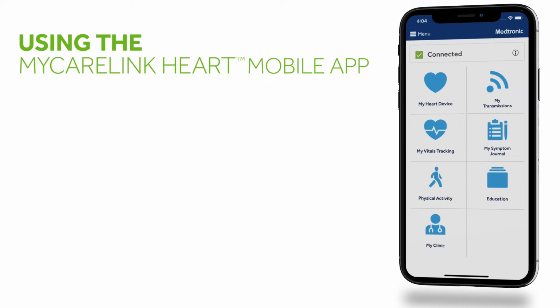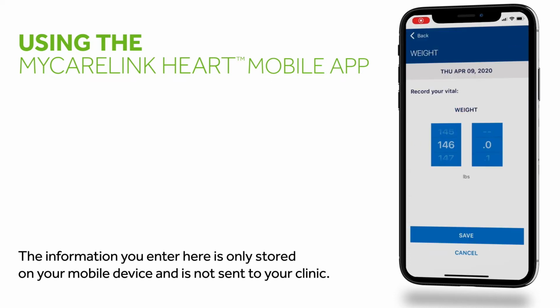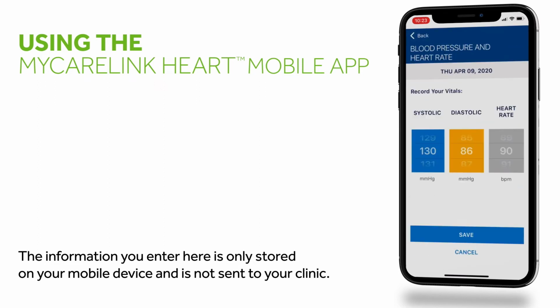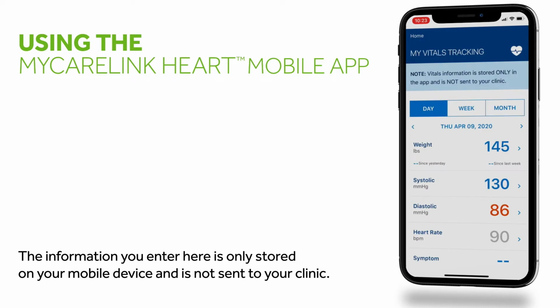The My Vitals tracking tile lets you record your weight, blood pressure, and heart rate, and track these measurements over time to help you better understand your health status. You can share this information with your clinician at your next in-office visit.